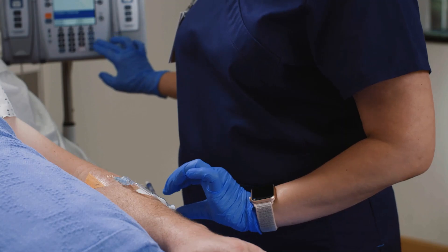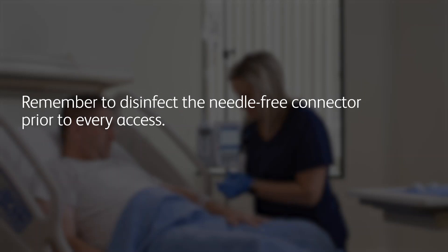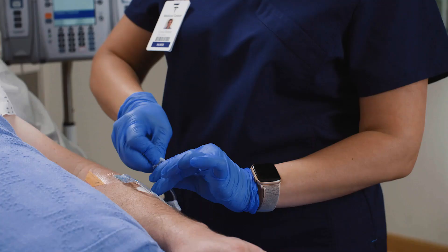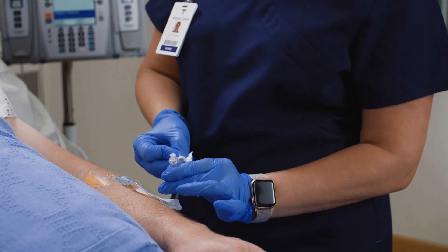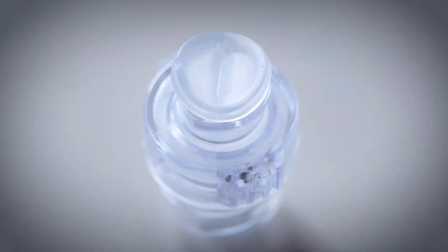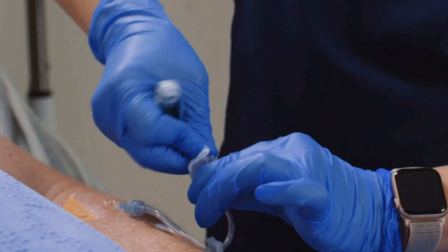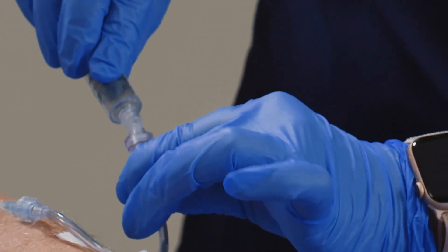Remember to disinfect the needle-free connector prior to every access. Scrub the access port with alcohol or another approved antiseptic agent. Let the device dry to complete the disinfection process. The BD Q-Site connector features a sealed surface that allows you to clean and disinfect at the access point. The connector also includes a clear housing, which enables visibility while flushing.